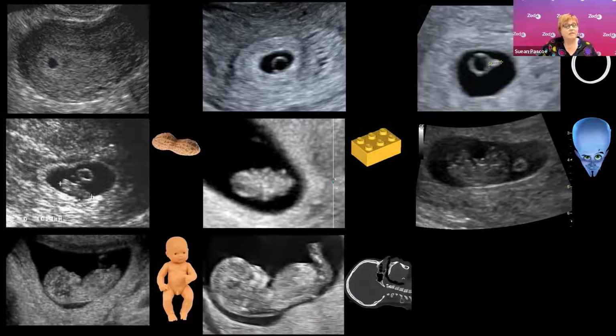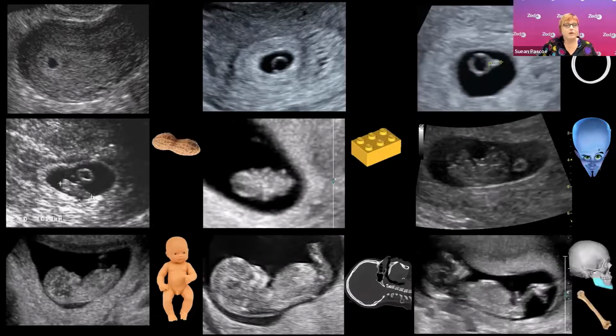At 11 weeks, we have ossification of the cranial vault. And so you start to see the perimeter or the very rim of the skull bones there. And when we get to the 12-week mark, we should start to see ossification of the jawbone and differentiation of the different bones, long bones of the arms and legs. And if you're looking, you can start to notice things like the bladder and the stomach and fingers and toes.